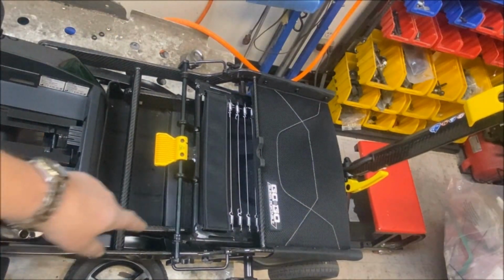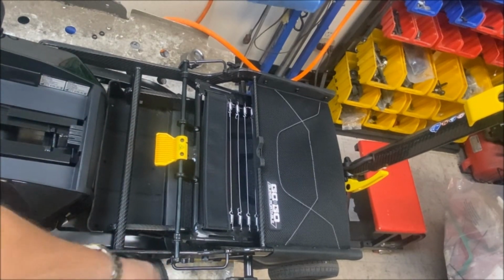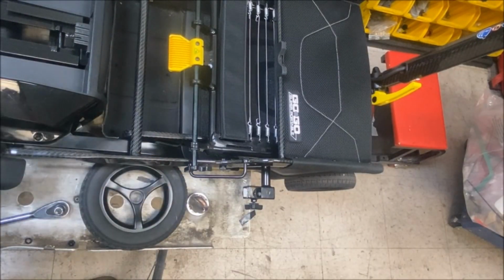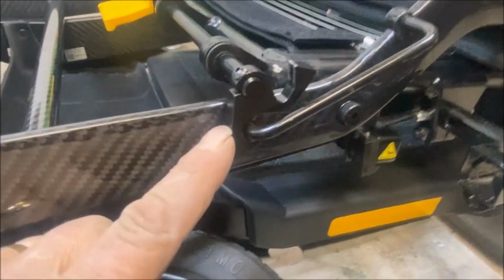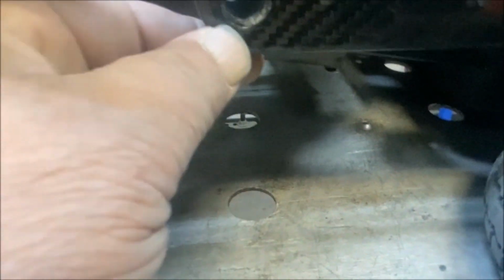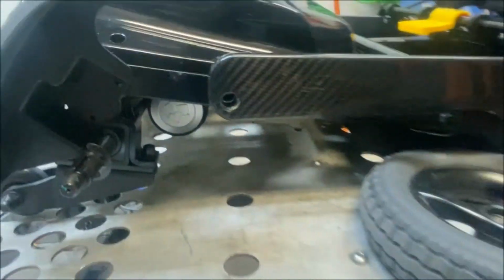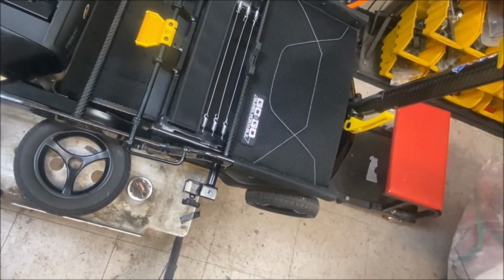Okay, so you've got to make sure you lift this handle and it locks into this folded position, otherwise you won't get the nut. If this is not in its locked position, it won't align properly. So stick it back up there.